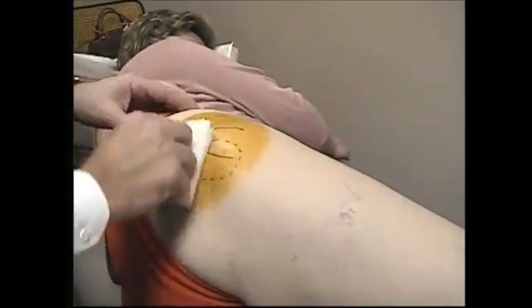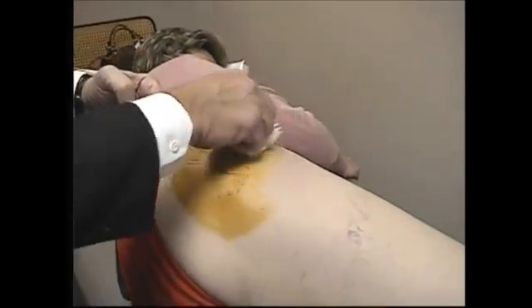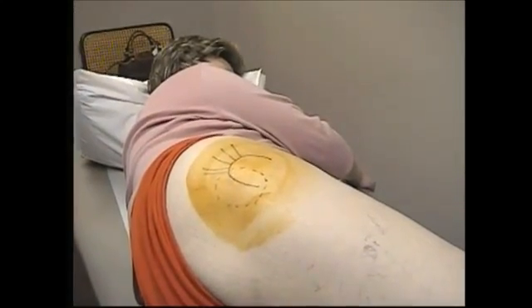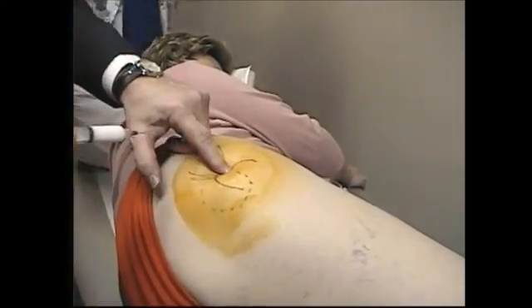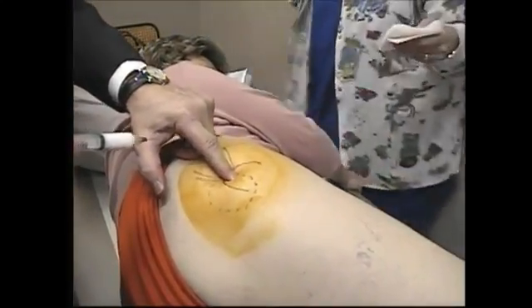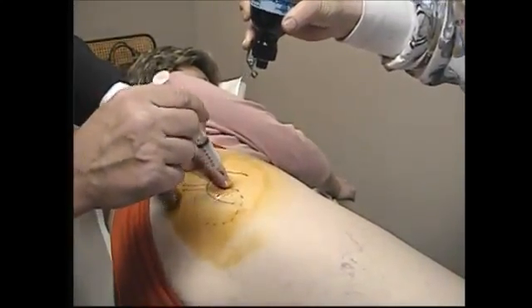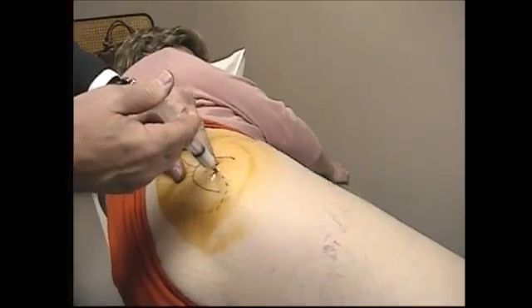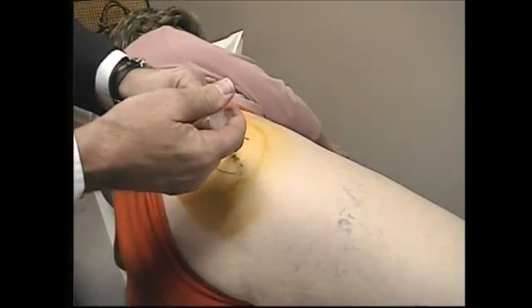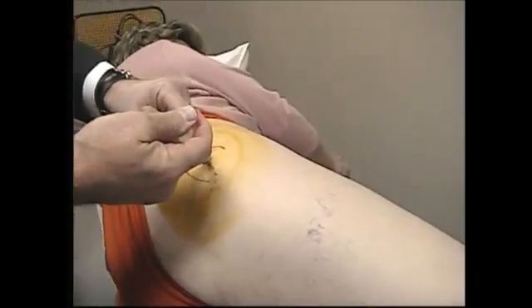Next, we're going to prep this area. We're going to come in here and press right where it hurts. There's a pretty good amount of tenderness right there. It's going to be cold. There's going to be some burning.